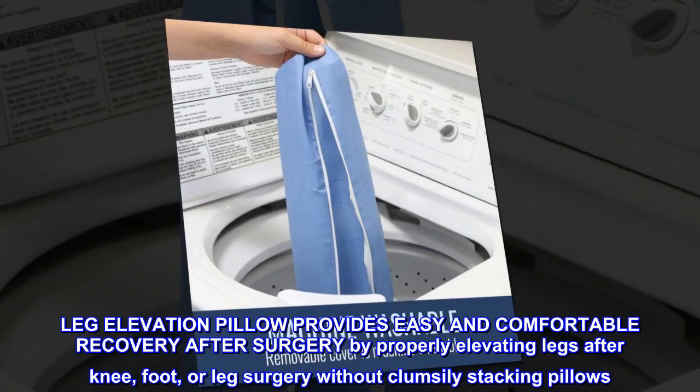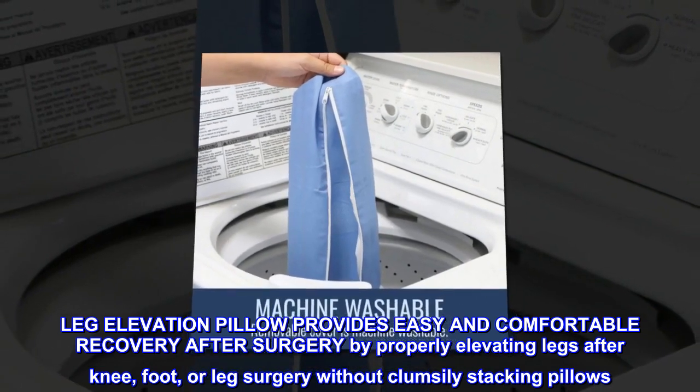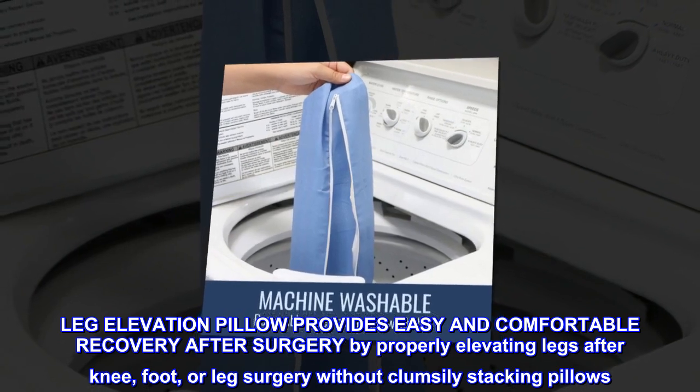The leg elevation pillow provides easy and comfortable recovery after surgery by properly elevating legs after knee, foot, or leg surgery without clumsily stacking pillows.